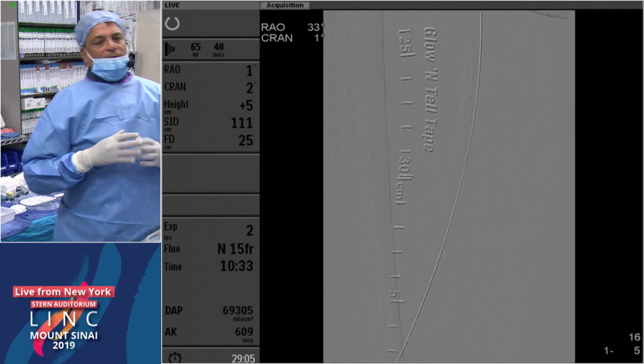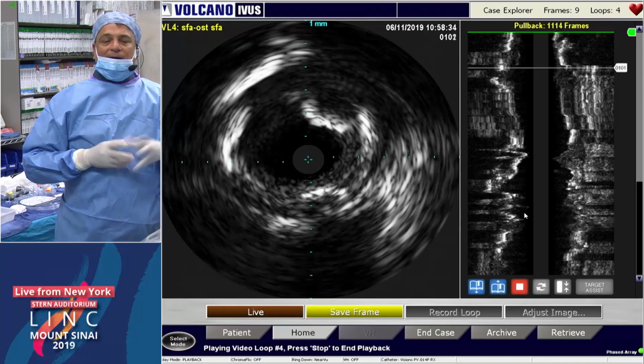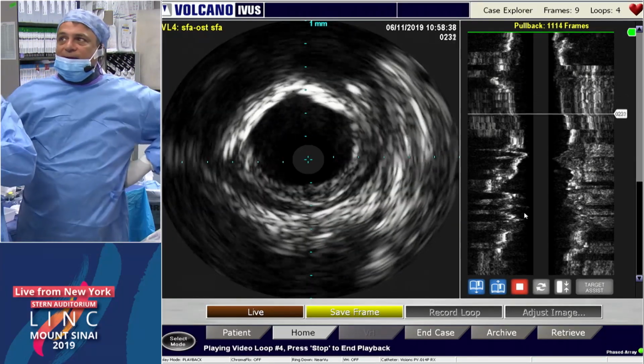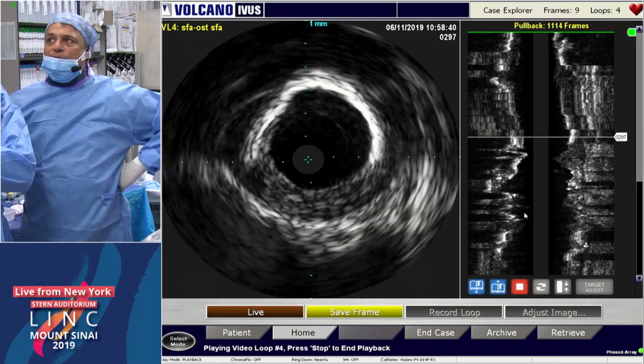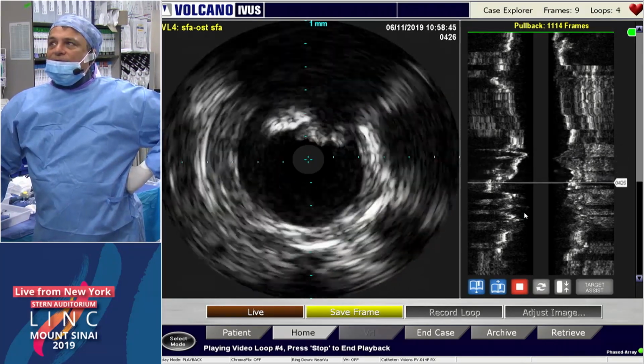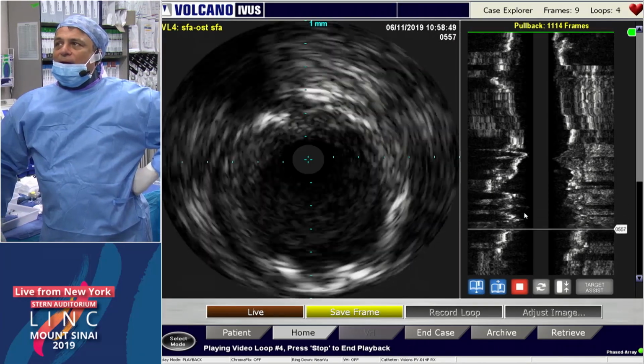And I think this is important when we have calcified lesions like this to do an ultrasound. I learned this from Dr. Robertus, where he always says, figure out the areas with the gradients and then take care of the gradients. We use ultrasound because this eccentric calcium makes it difficult to see the severity of the stenosis. So this is coming from the popliteal up, right?